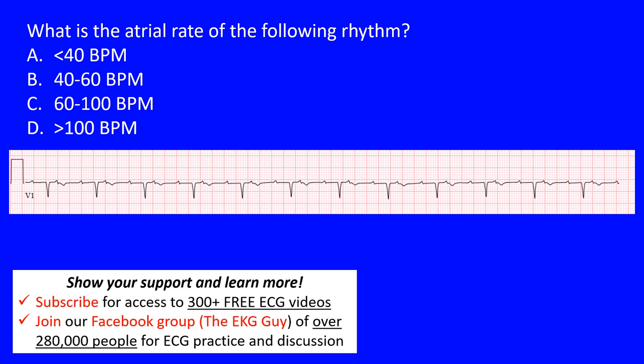Here we have a question looking at the rate of a rhythm. Specifically, it asks: what is the atrial rate of this rhythm here in V1? It gives a number of different rates — is it less than 40 beats per minute, between 40 and 60, between 60 and 100, or over 100 beats per minute?